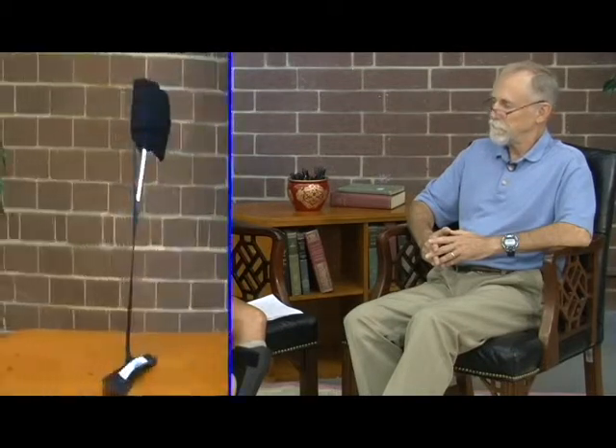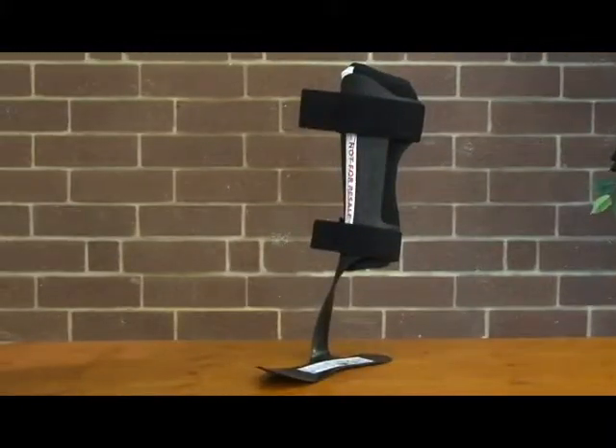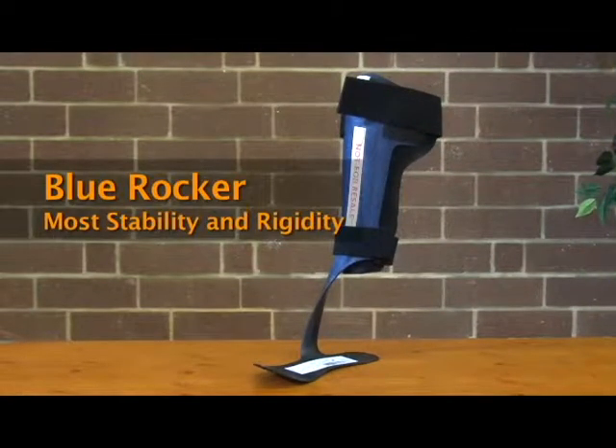We are using Allard's products. They make three different types — it's a dynamic response AFO. There's a very flexible version called the Ipsilon, a medium flexibility and support version called the Toe-Off, and then the very supportive, slightly more rigid version called the Blue Rocker. So these were the three options we had when figuring out what was going to work best for me.